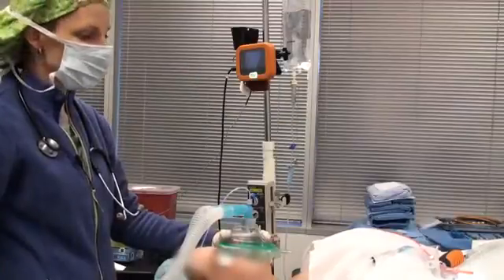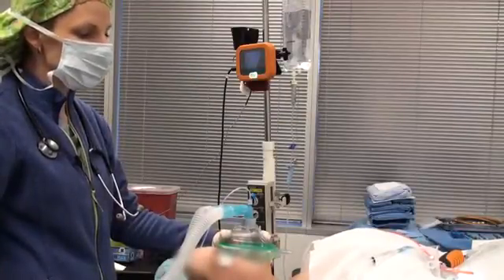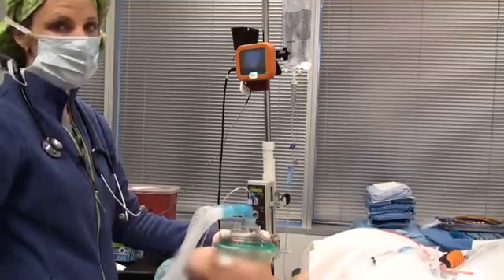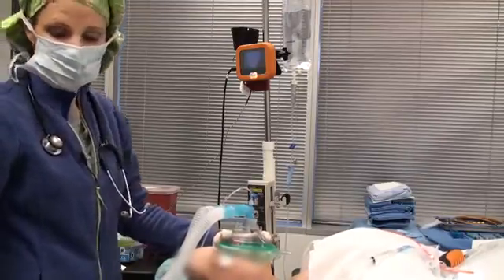So today we're doing a bougie port intubation. I already have the bougie preloaded into the disposable sheath and the co-pilot is turned on so that we're heating up the sheath so it doesn't fog.